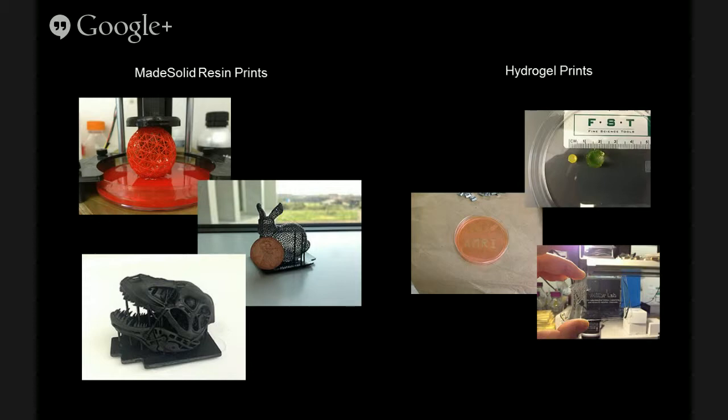In that case of the glass, you've got the sugar, and then you pour in a mix of hydrogel and cells, and that's going to set, and then you can wash the glass out of that. So then you've got your vascular system in this hydrogel slab. So that's one approach. Other approaches, you'll just create a really loose, open structure that your cells can adhere to, and then you can wash your media through that. But there's enough open surface, and then eventually your cells consume that material, or it just kind of evaporates over time.